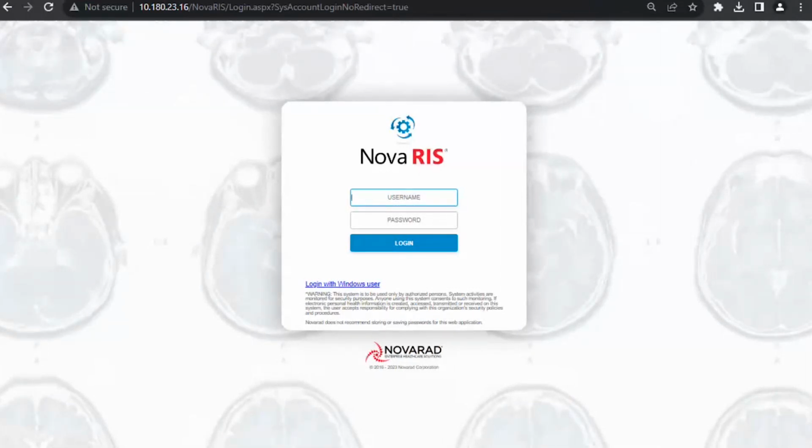So today we're going to talk about the RIS. Many of you have already been hearing about PACS and other areas this morning and on other days. Today we're going to give you more information about our RIS solution. This is the full RIS. Some of you may already be using our solutions, and in some cases you might be using only our PACS and the report side for management. Others of you may be using the full RIS solution.